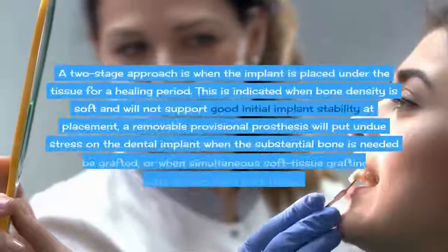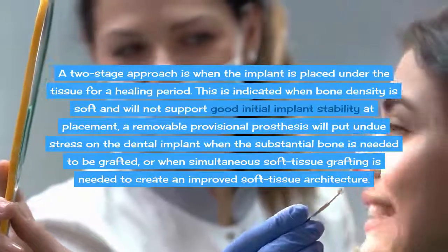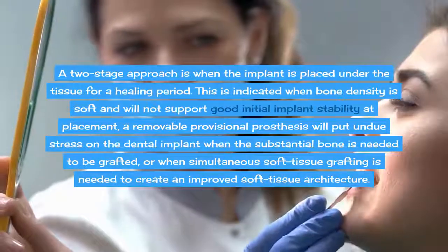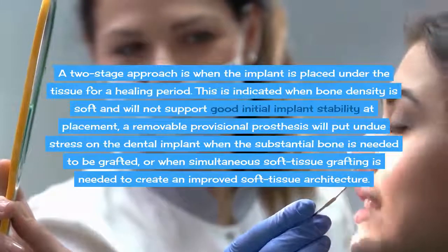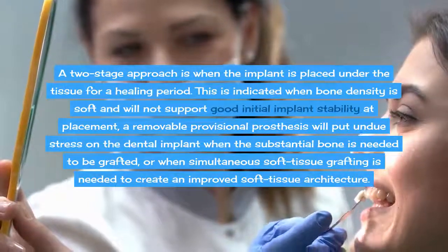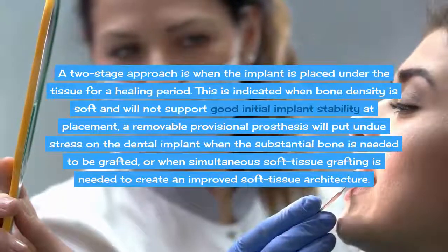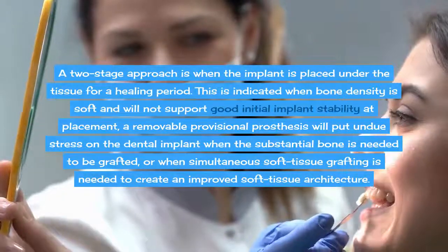A two-stage approach is when the implant is placed under the tissue for a healing period. This is indicated when bone density is soft and will not support good initial implant stability at placement. A removable provisional prosthesis will put undue stress on the dental implant when substantial bone needs to be grafted, or when simultaneous soft tissue grafting is needed to create an improved soft tissue architecture.